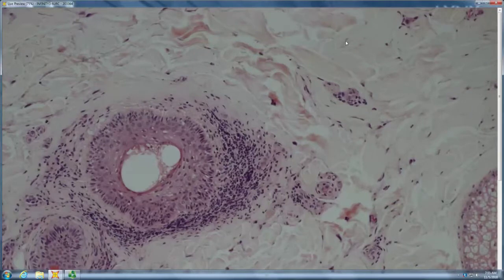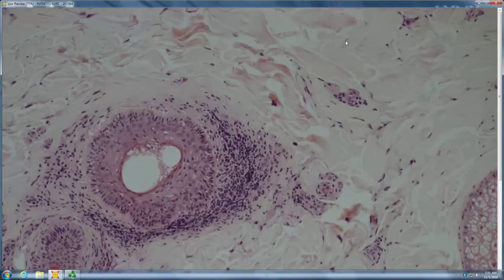So when you have a spongiotic infundibular folliculitis with some lymphs, that's just seborrheic dermatitis. When you're up towards the surface, you might have a little scale crust by the follicular ostia, but that's sebderm. You commonly see it as a background in alopecia biopsies. So it usually doesn't mean much other than the guy needs a little Selsun, right?